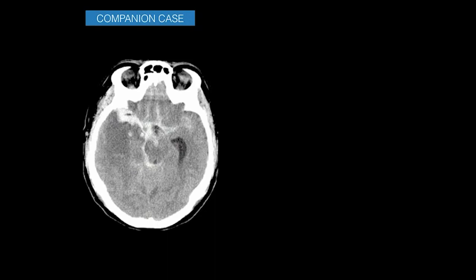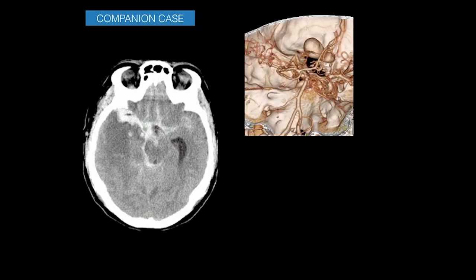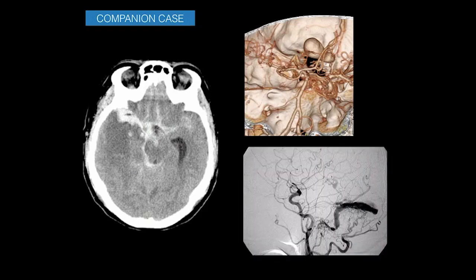Sometimes the pattern of subarachnoid bleed and parenchymal hematoma appears atypical — as in a case with edema in the right temporal lobe, midline shift, and possible early hydrocephalus. CT angiogram showed no aneurysm, but prominent venous channels were seen along the floor of the anterior cranial fossa. DSA demonstrated a dural AV fistula draining into the transverse sinus. A dural AVF can present with venous hypertension and parenchymal bleed extending into the subarachnoid space, mimicking aneurysmal SAH.